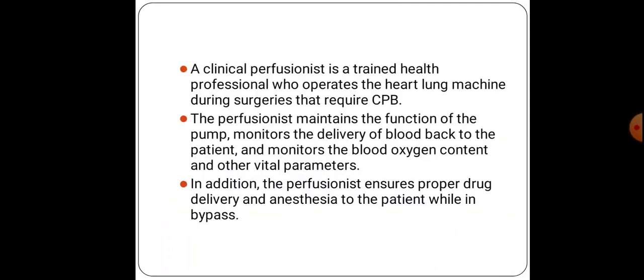There will be a perfusionist. Why do we take the help of a perfusionist? A clinical perfusionist is a trained health professional who operates the heart-lung machine during surgeries that require CPB, which means cardiopulmonary bypass.